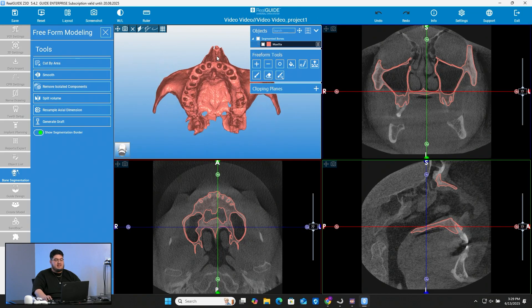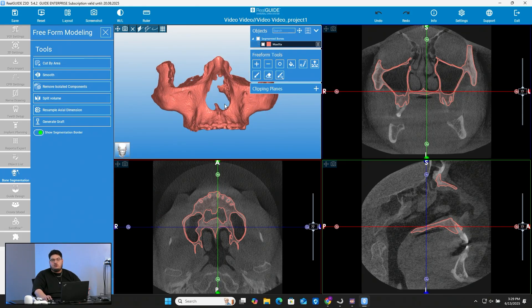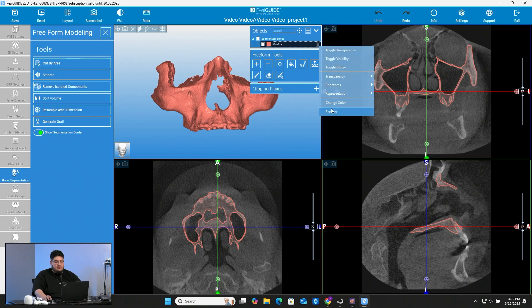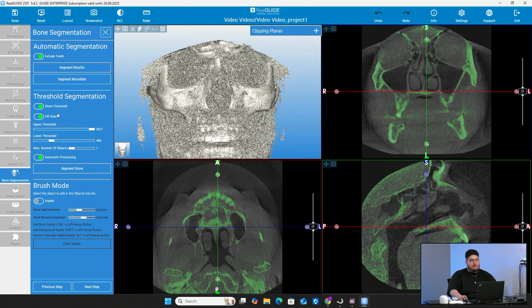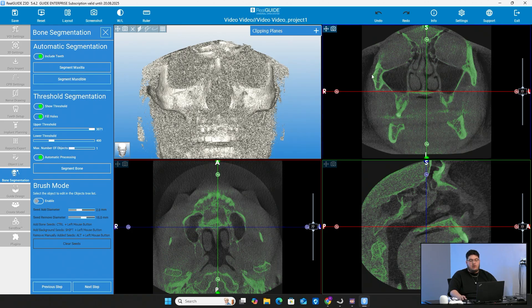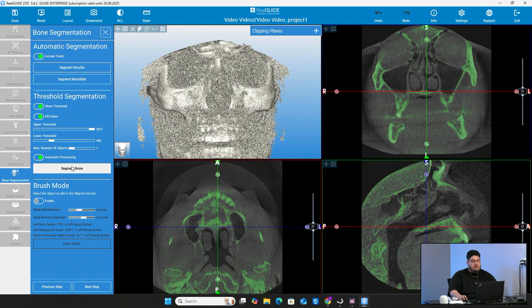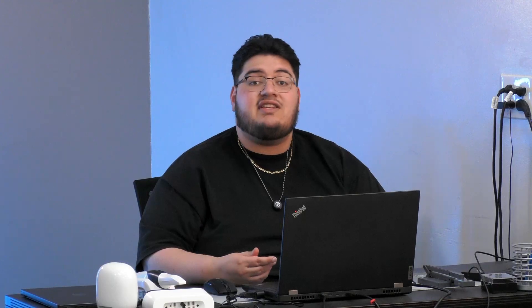What you'll see prompted up is actually the bone segmentation I had already done. So we're going to get rid of this and remove it and go back. What should actually pop up right when you press segmentation on bone is this prompt. You have different settings: the threshold segmentation is more of a manual segmentation where you mark the actual bone highlighted in green, and you can change the upper threshold. Even with the brush mode down here, that's another manual option. But RealGuide is really good at being able to segment the bone itself automatically.